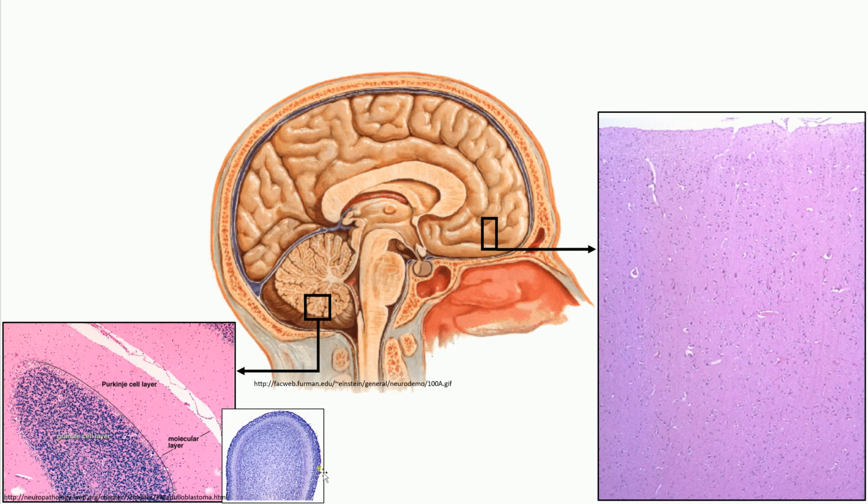It is believed that in certain cases, a tumor called medulloblastoma is recapitulating the small round blue cells of the external granule cell layer that is present in the fetus and young baby less than 1 year of age. So again, in the cerebral hemispheres, there are astrocytes and oligodendroglial cells, which can give rise to astrocytomas and oligodendrogliomas. Those can certainly happen in the cerebellum as well, but what is more common, typically in children, are the medulloblastomas, which is believed to arise from this external granule cell layer, or recapitulates the external granule cell layer.